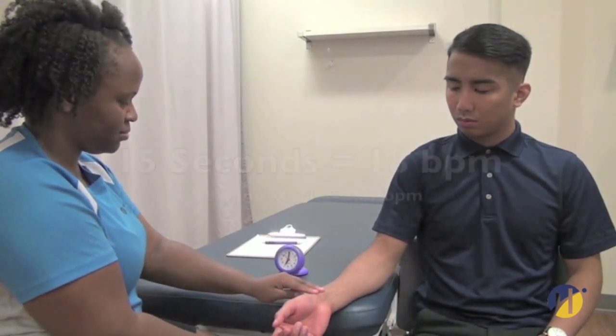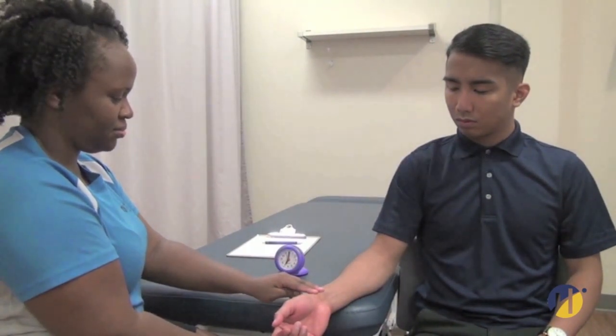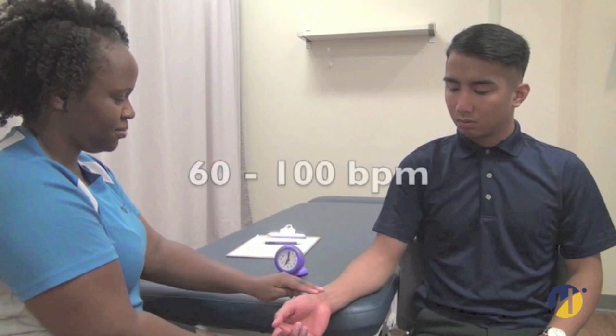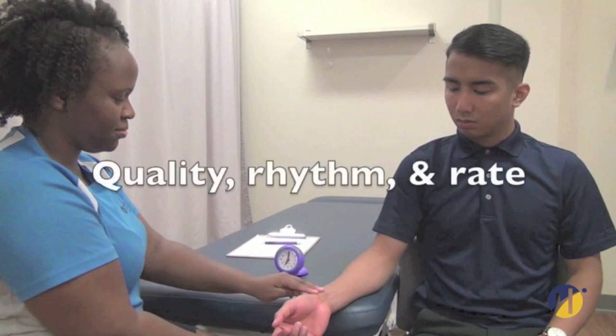If the measurement was taken for 15 seconds, multiply your result by 4. If the measurement was taken for 30 seconds, multiply your result by 2. In an adult, the normal heart rate is 60 to 100 beats per minute. While you are assessing the heart rate and the pulse rate, you are noting the quality, the rhythm, and the rate of the heart rate.